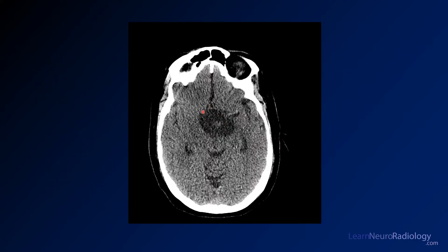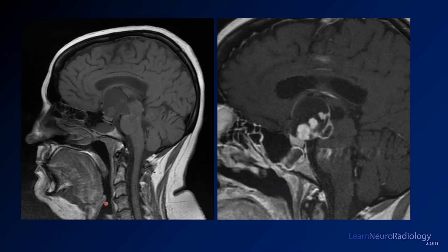On the CT, there's a predominantly low-density mass in the suprasellar region, with maybe a little bit of intermediate density material centrally. On the pre- and post-contrast imaging, you have this large mass expanding the sella — the pituitary is probably preserved here, enhancing normally — but on the post-contrast imaging you have areas of cystic non-enhancement with nodular areas centrally that are enhancing. That's pretty classic for craniopharyngioma.